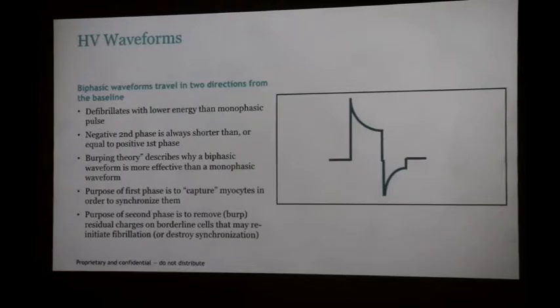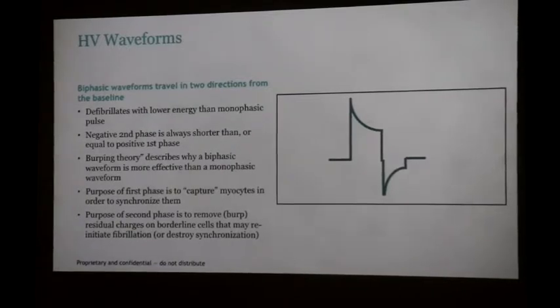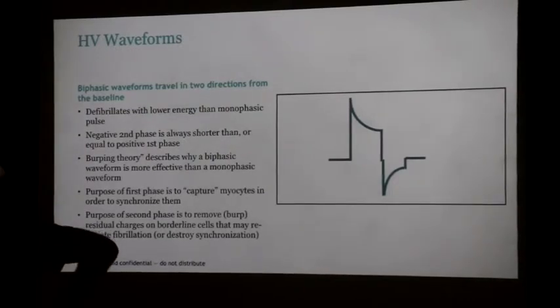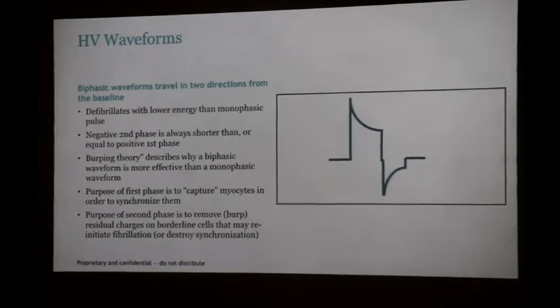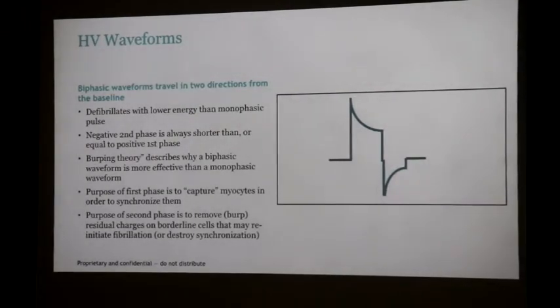Yes. Does Abbott do them? No, we have one in development. Because they're actually good, because you're not pacing from the sternum. Your coil is shocking from here to under the muscle somewhere thoracic there. So I think that goes to your left ventricle. That's like an AP shot, right? Yes. Works nicely, and lots of joules. 80 joules. But you have a problem with pacing.